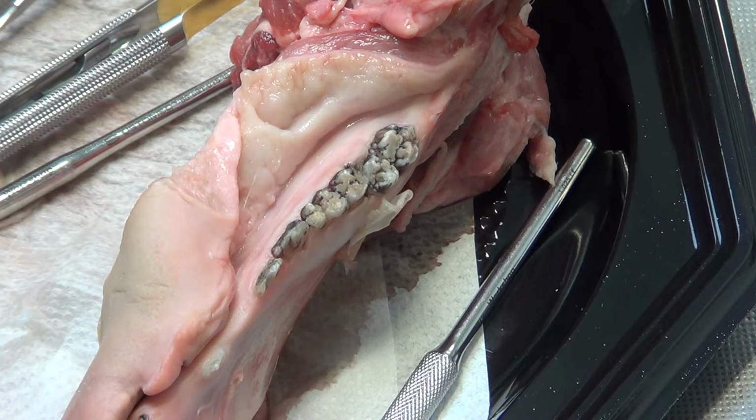So also the third one, this is one of the really difficult sutures to do, because it's not simple to go under the periosteum. Sometimes you need 2 steps. But I want to underline, it's necessary to maintain the periosteum here. If you elevate the flap with the full thickness with the elevator, you remove the periosteum, so you are not able to fix this type of suture, and the mucosa goes up, so it doesn't work.